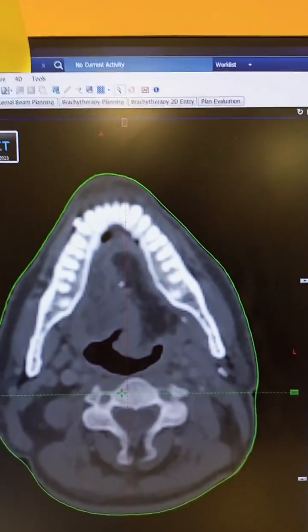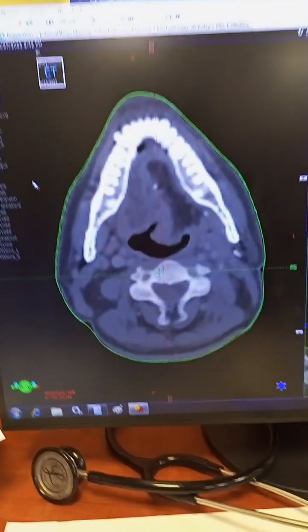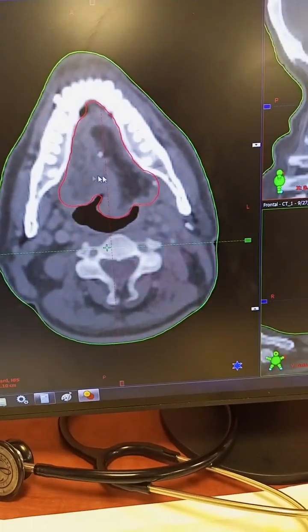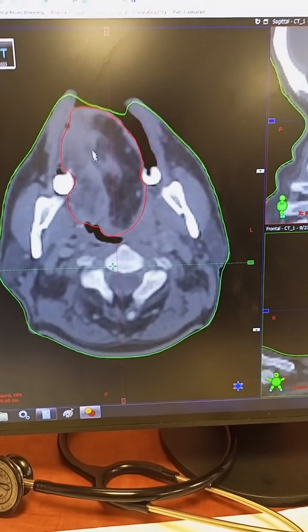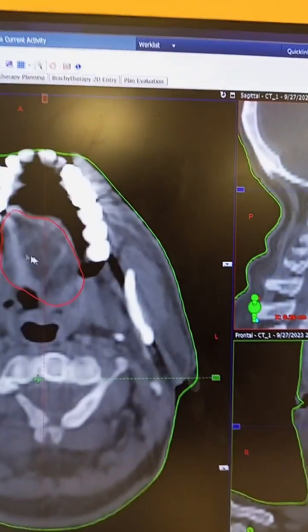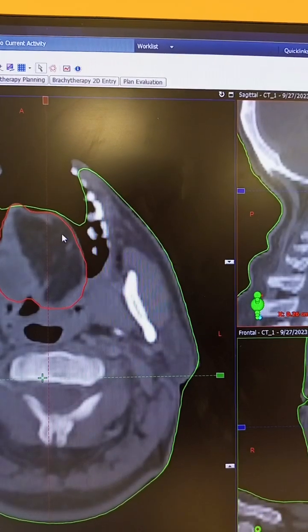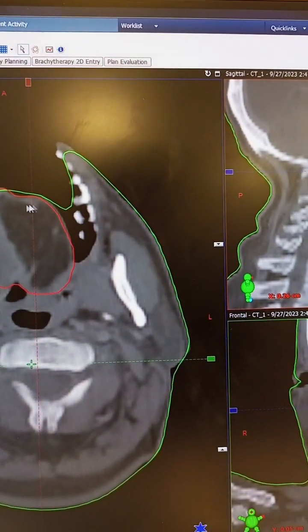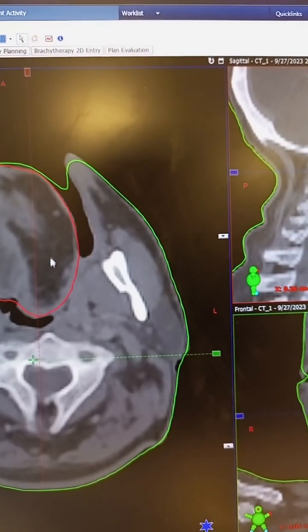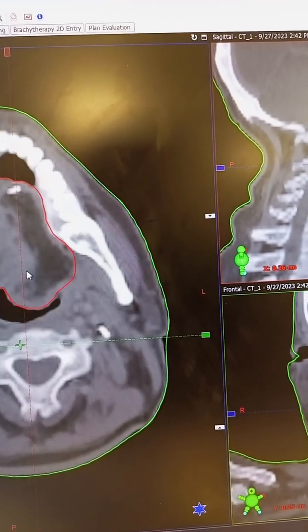The preformed body or skin of this patient has already been contoured. Next we need to contour the CTV. This is the CTV we have drawn for this patient — the CTV of the tongue. It includes the tongue where the patient is at risk of developing tumor. It includes the flap as well as the normal side in the CTV. The CTV includes all of the tongue.